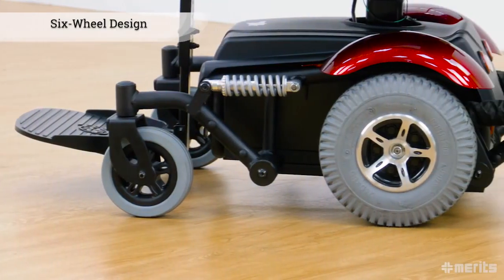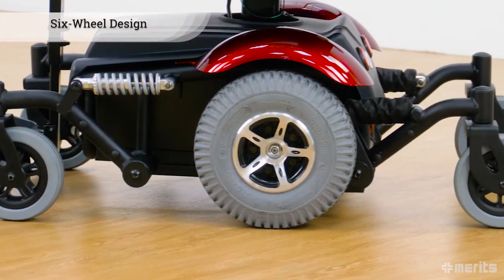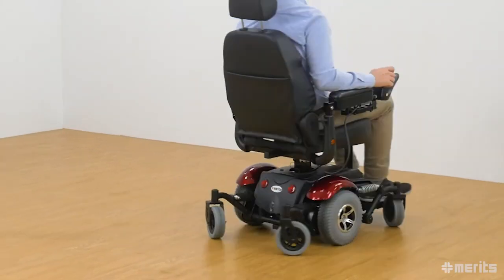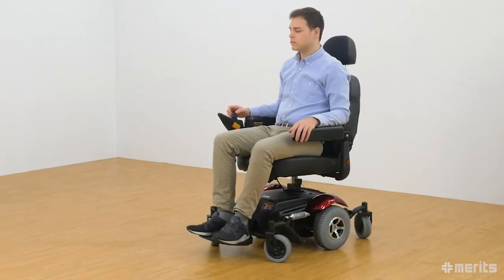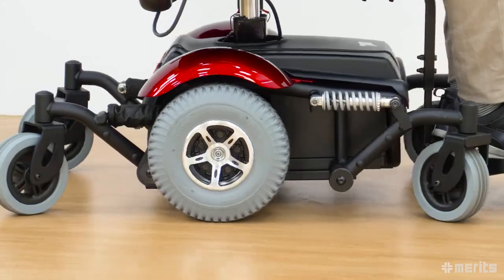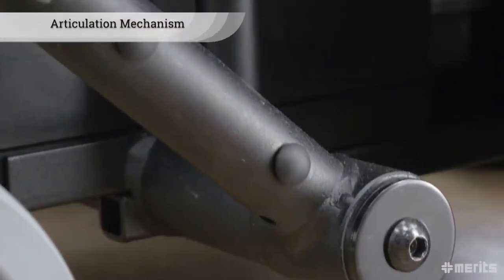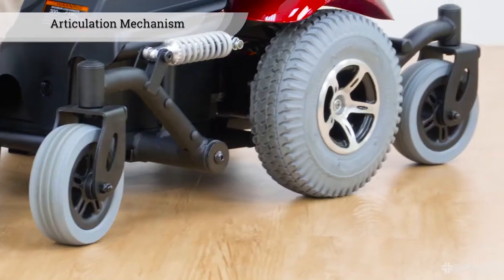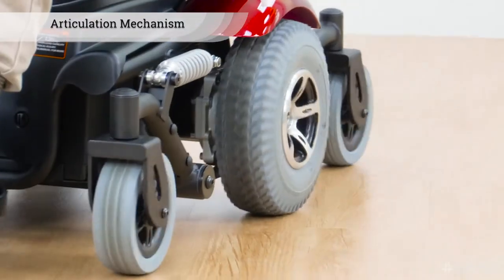The six-wheel design of the P326D provides unsurpassed stability. Its mid-wheel drive enhances manoeuvrability in tight quarters and provides for a low centre of gravity that guarantees a smooth and stable ride both indoors and outdoors. Meritz's patented articulation mechanism enables the front wheels to climb small steps while the two rear wheels provide stability.